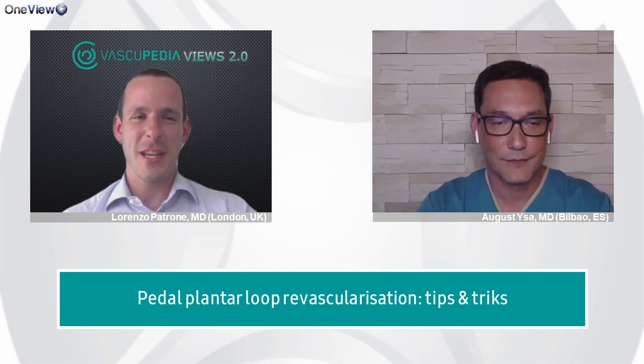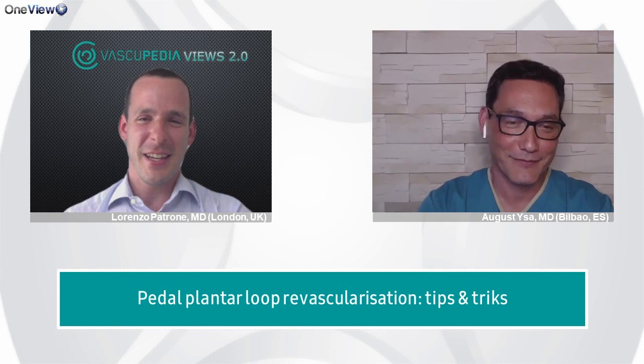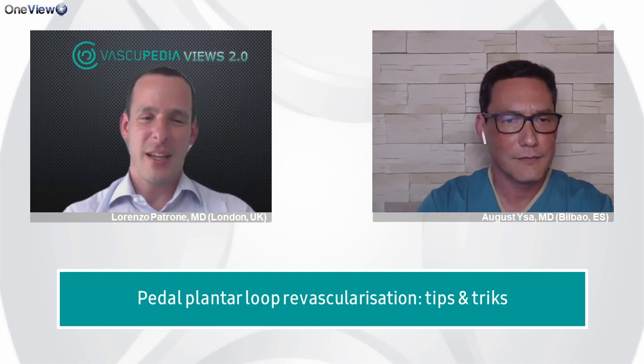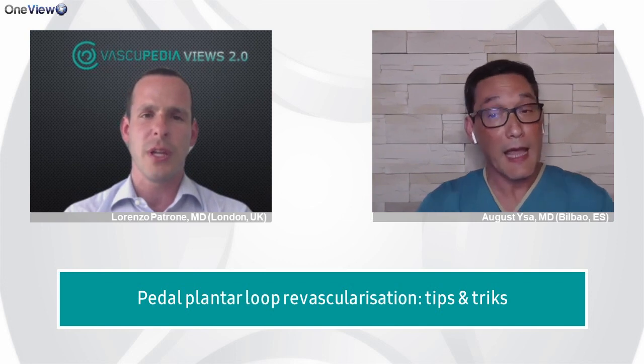It's also a very dangerous game for patients on dialysis, I think, because the fluid overload could be a proper issue. And when you put in the 5 French sheath, the 6 French sheath, you said even 7. Do you put in the 7 French when you want to do kissing balloons, or how do you choose the size of your sheath?